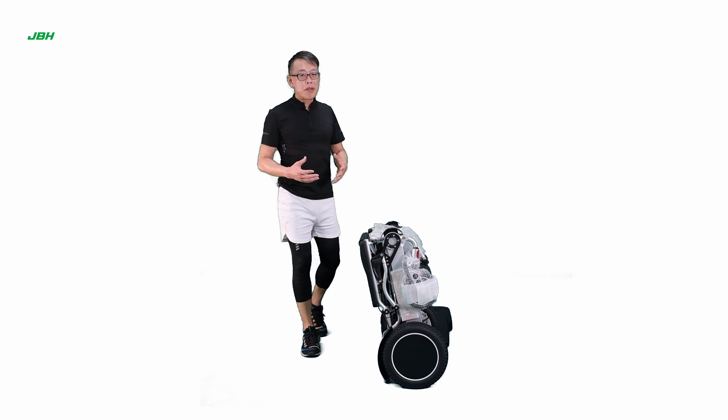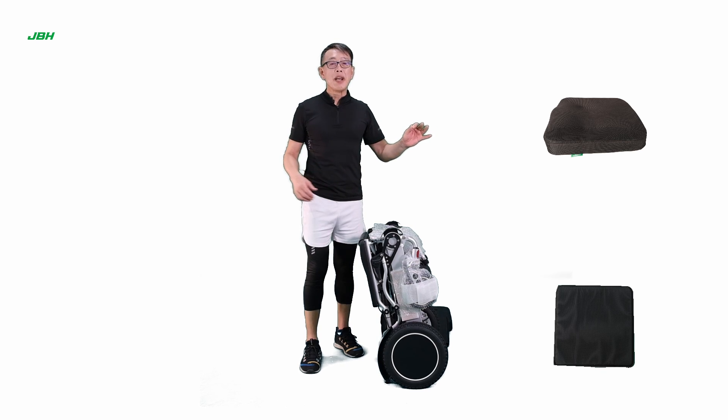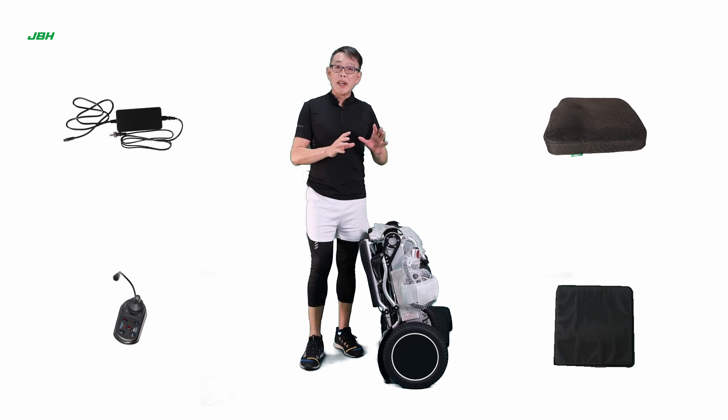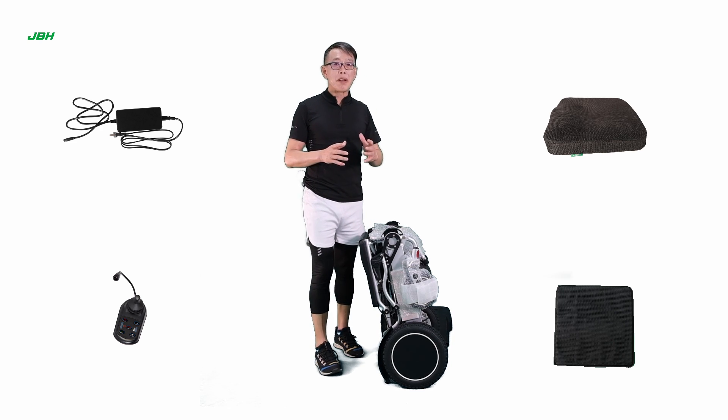Once we take out the wheelchair from the carton, we will find there is a seat back cushion, a charger, a controller, and a manual packed with some simple tools available for your use.